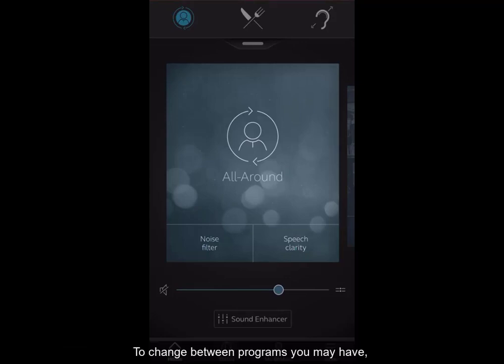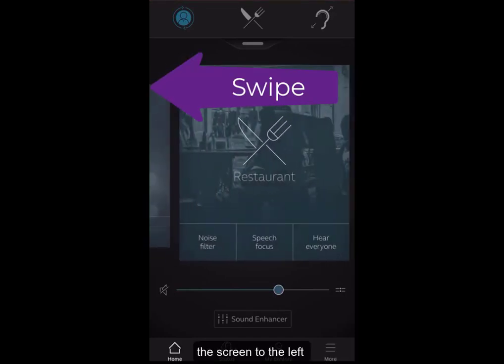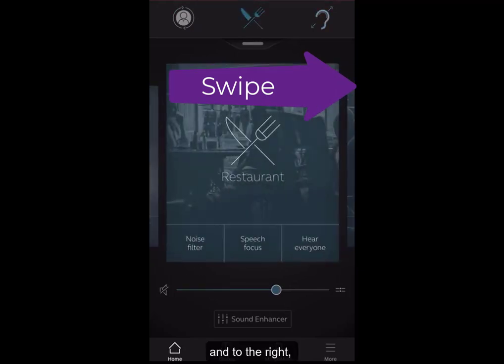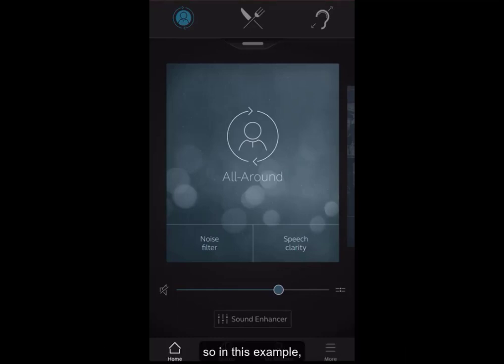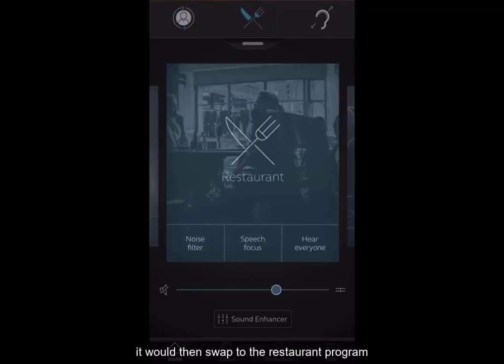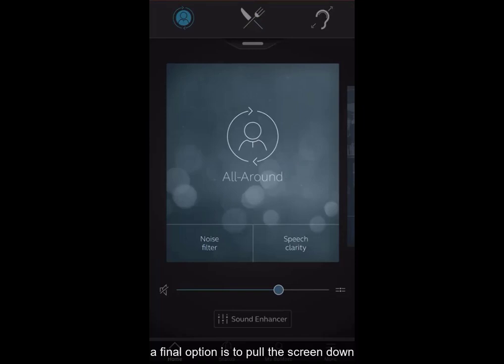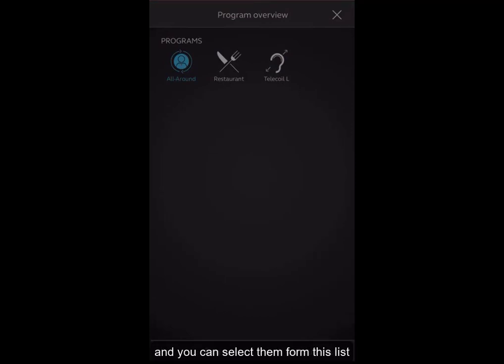To change between programmes you may have, you simply swipe the screen to the left and to the right. Alternatively, you can select the symbols at the top of the page — so in this example, the knife and fork, if I was to click on that, would then swap to the restaurant programme. A final option is to pull the screen down and this will give you a list of programmes that you have been given, and you can select them from this list.